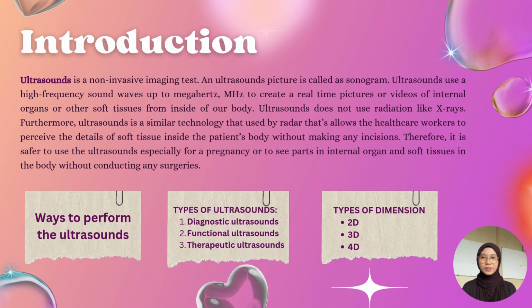The waves echo as they hit a dense object like bone or organ, and those echoes are then reflected back into the computer. Since the frequency of the sound wave is above the human hearing threshold, which is 20 kHz, these sounds will form a picture that can be interpreted by the doctors. Then the sonogram is produced.